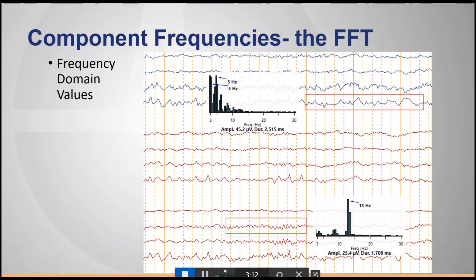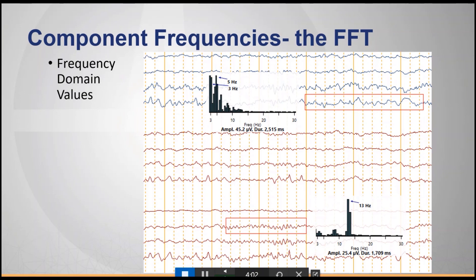We can use our measurement tool to drag a box around a time segment and generate an FFT frequency spectra. That could be virtually any length of time — in this example, about two and a half seconds, but it could be two minutes or pretty much anything. In this selected segment, the component frequencies are predominated by five hertz and three hertz activity, with the y-axis being power and the x-axis being frequency, ranging from zero to 30 hertz.